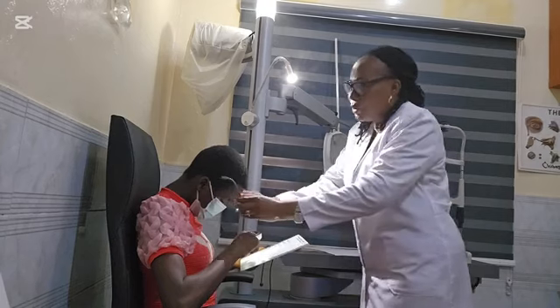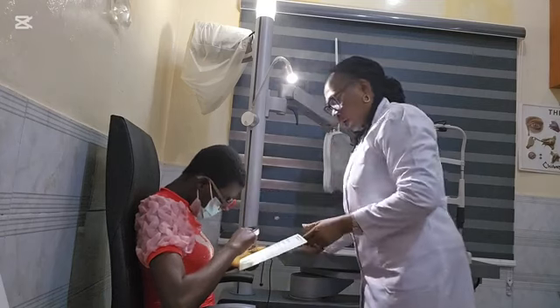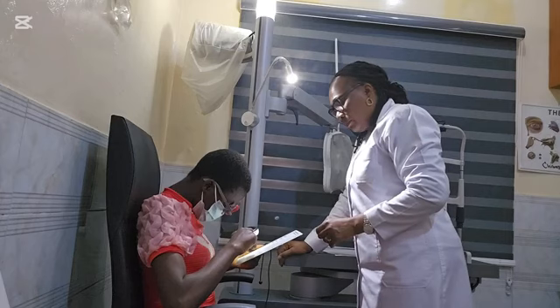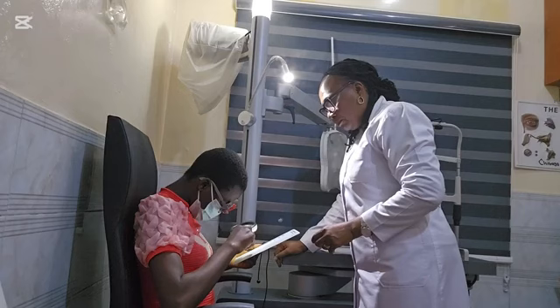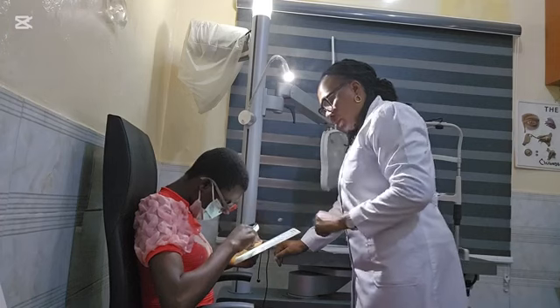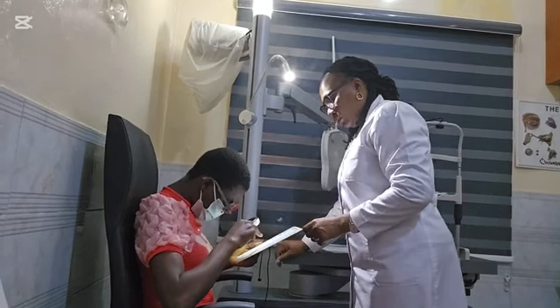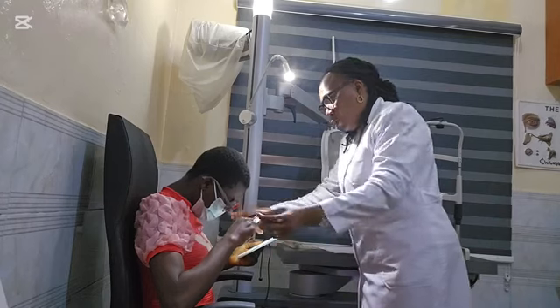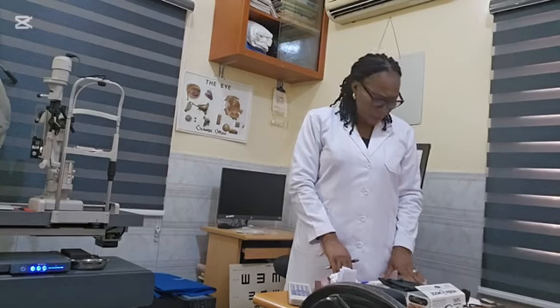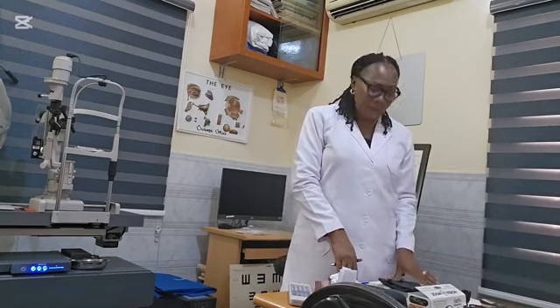So let's see how she reads through her distance spectacle. Okay, go ahead and read the last one you just read now. Is it clearer? No. Which do you prefer? Let's see what you can read. So do you prefer to read through this or without it? Without it? Okay, beautiful.